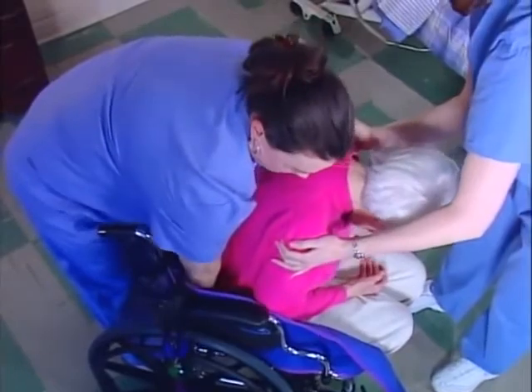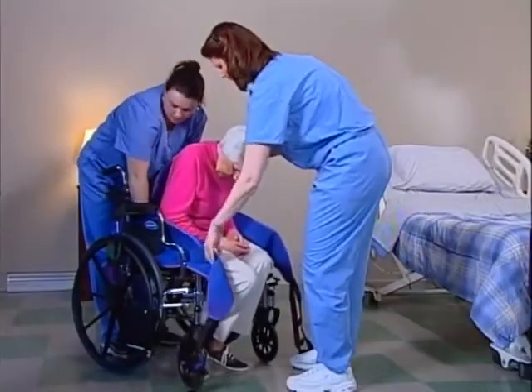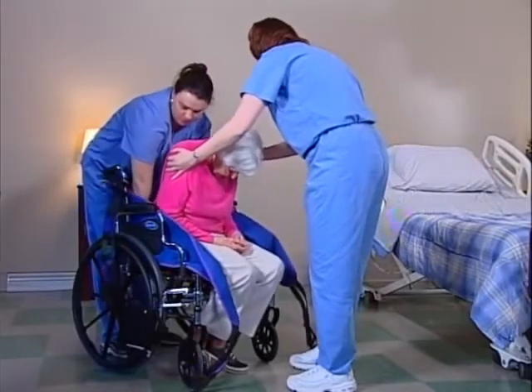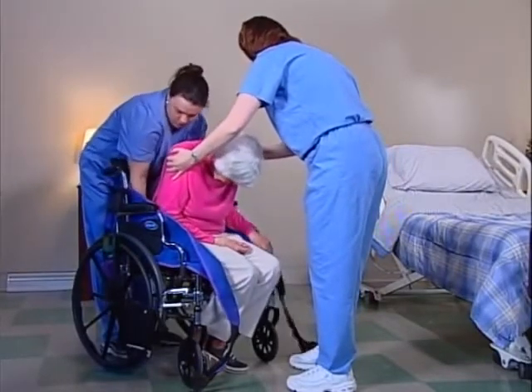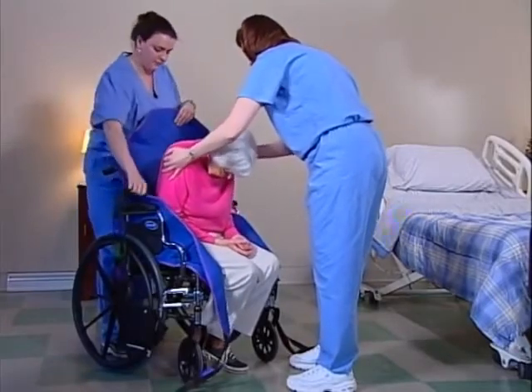Make sure it is straight and parallel to the resident's shoulders. Push the bottom of the sling to the seat. Position the straps as far forward in the seat as possible. Lean the resident back in the wheelchair.